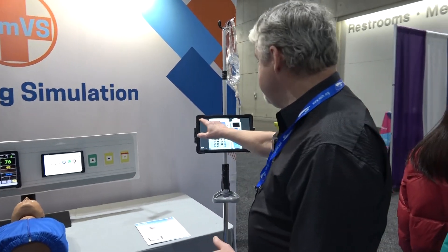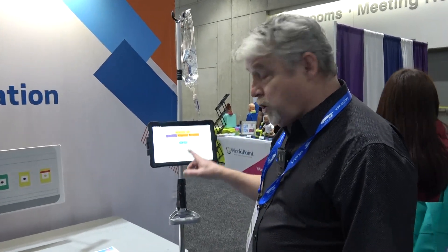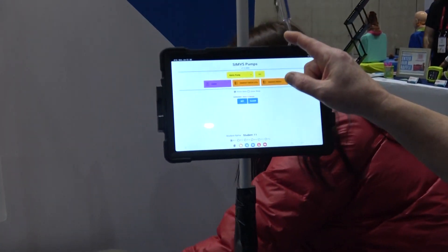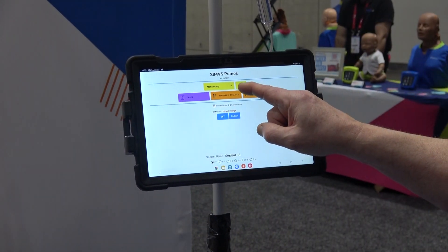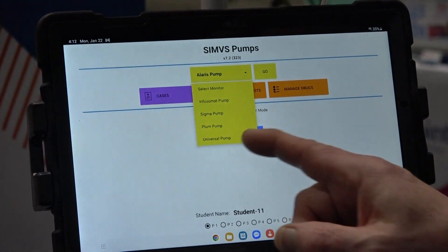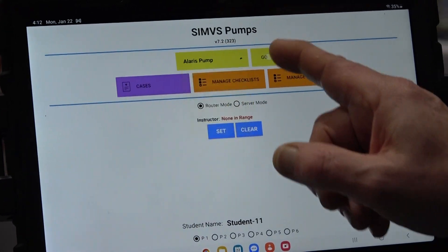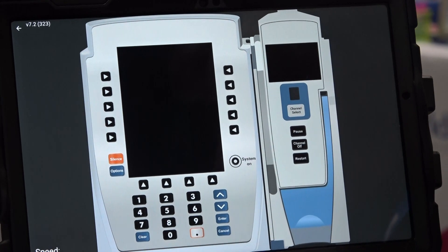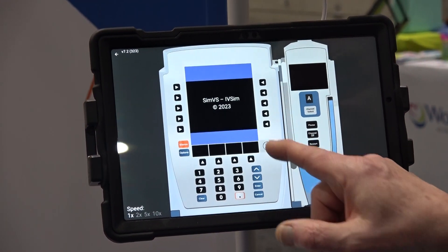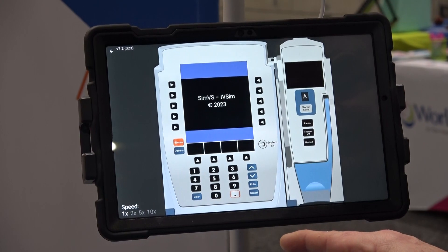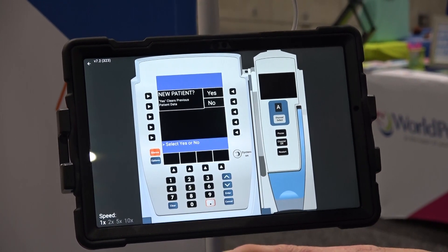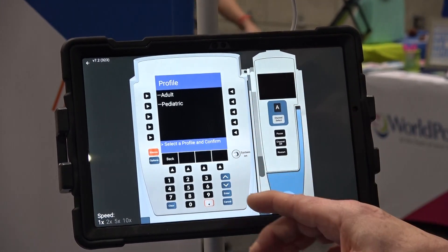We'll start with the IV pump. As I mentioned, this is the world's first IV pump simulator. We simulate four different types of interfaces — the four most popular: the Alaris, Infusomat, Sigma, and Plum. Let's go to the Alaris. The interfaces look exactly like the real product and work exactly like the real product. We can turn it on and it'll go through its sequence.